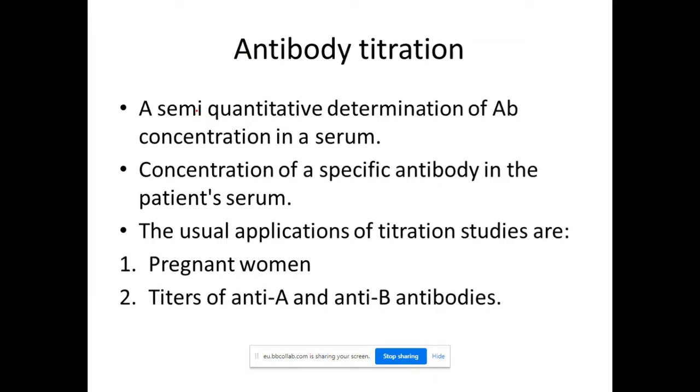No, I think there are different reasons, but this is one of them: hemolytic disease of the newborn as a result of maternal antibodies. So let's move to antibody titration.